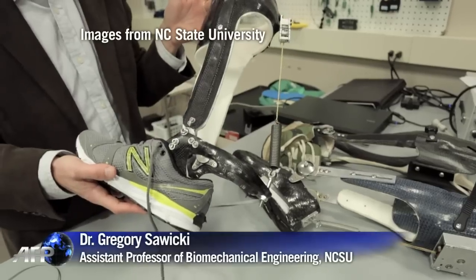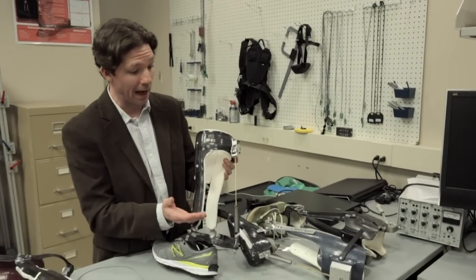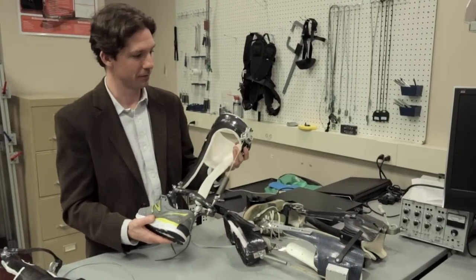What I'm holding here is a passive elastic ankle exoskeleton. It uses no battery and no motors in order to reduce the energy cost of human walking.